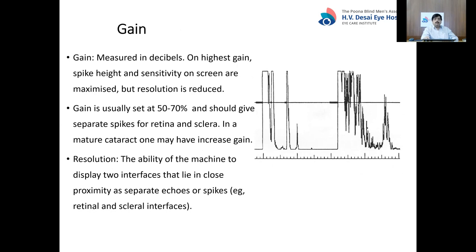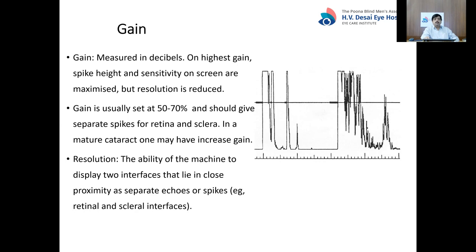Gain in biometry is measured in decibels. The higher the gain, the higher the spike height and sensitivity, but resolution is reduced. Normally, gain is kept at 50 to 70 percent — at this setting, you should get separate spikes for the retina and the sclera. If they merge into one fat spike, the gain is excessive. In a mature cataract, you may need to increase the gain because a lot of sound waves are reflected back from the dense lens. Resolution is the ability to display two closely spaced interfaces as separate echoes.